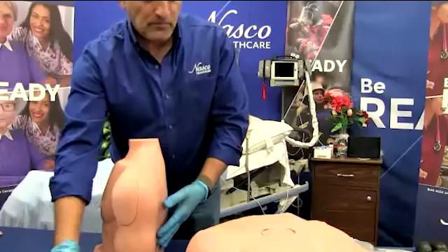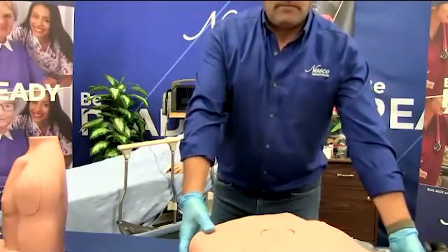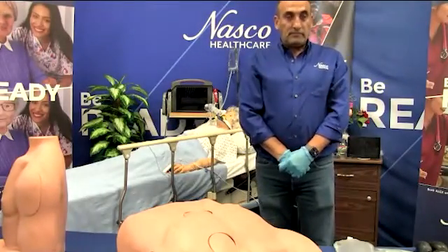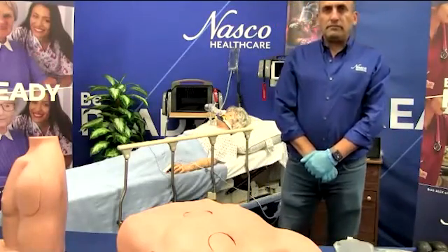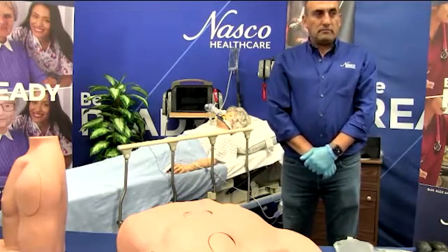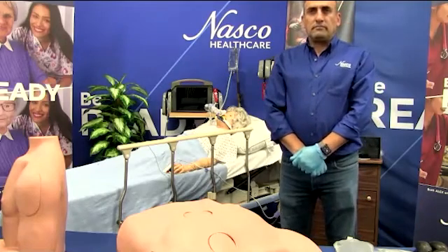Before moving on to our next product, do we have any questions regarding the humerus IO trainer? Anna? The first question is: can blood be added to observe the flashback? And also, can fluid be infused into the bone of the trainer? That is actually a very good question. The answer is no — the trainer is for needle placement practice only.